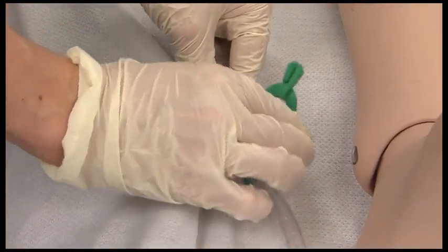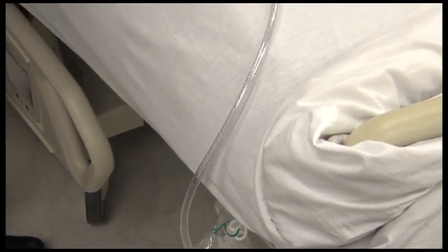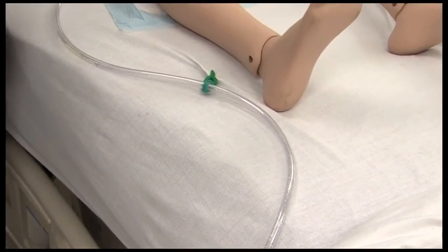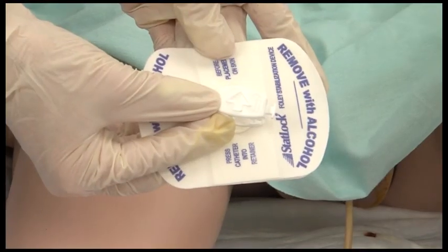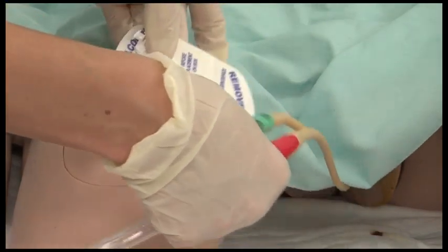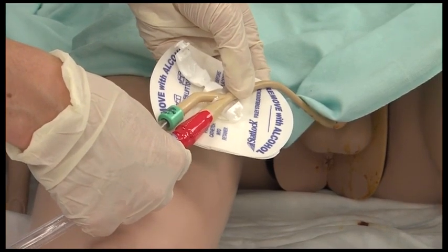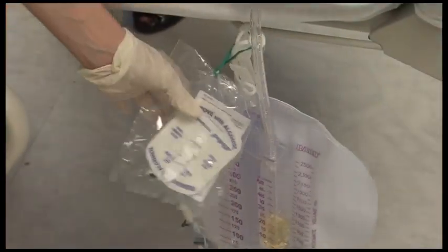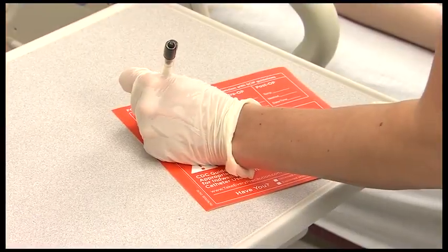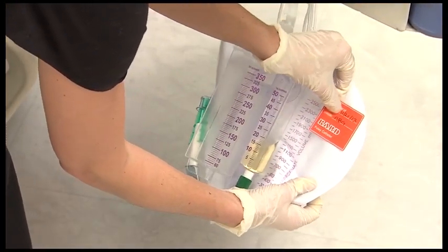Utilize the green sheeting clip to secure drainage tube to the sheet and avoid dependent loops. Maintain unobstructed urine flow and keep the catheter and collection tube free from kinking and dependent loops. Secure the catheter to the patient's thigh using the StatLock Foley stabilization device located in a bag hanging from the drainage hanger, or with the device currently being utilized at your facility. Proper use of the StatLock stabilization device will be discussed at the end of this video. Complete the orange stickers that were set aside earlier in order to document the procedure according to hospital policy.